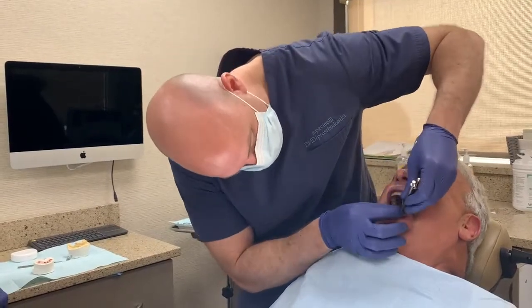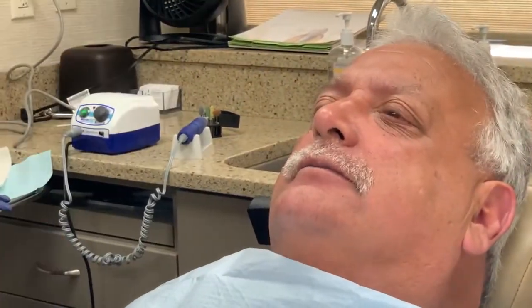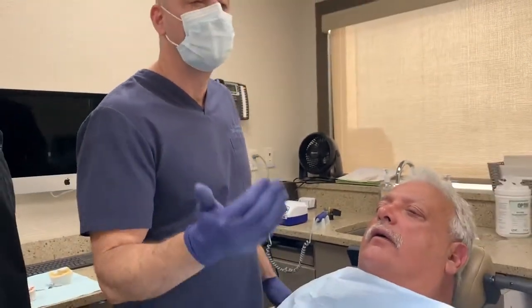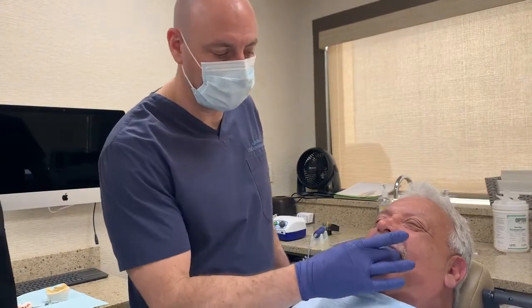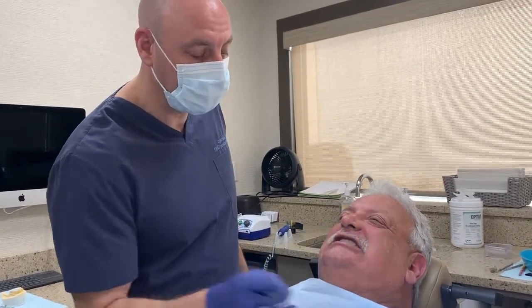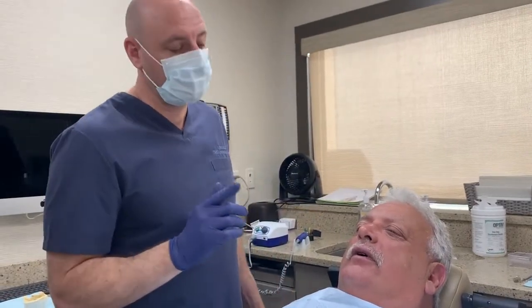He's only talking to 15. Yeah. Grind your teeth side to side. Good. And open for me. And again, if you look at his occlusion, his anterior teeth are not in occlusion. Because if his anterior teeth were in occlusion, with the vertical that he has, bite down for me, I would have to either lengthen the teeth, or close his vertical down, or move the teeth in. But we opened them up.